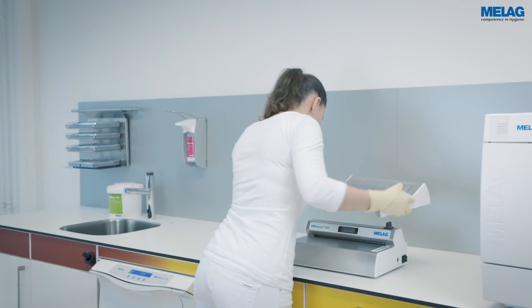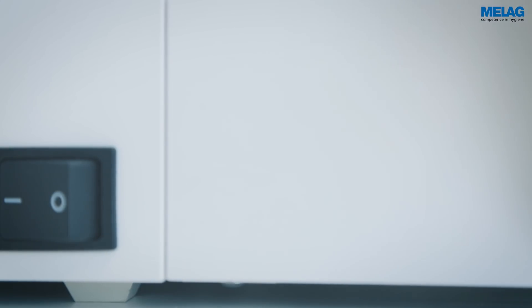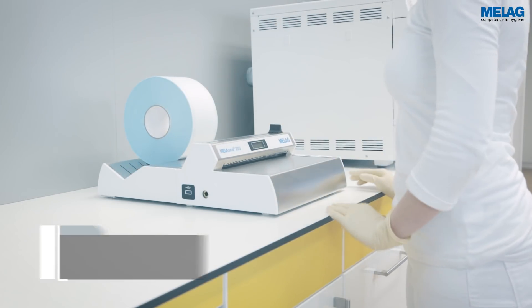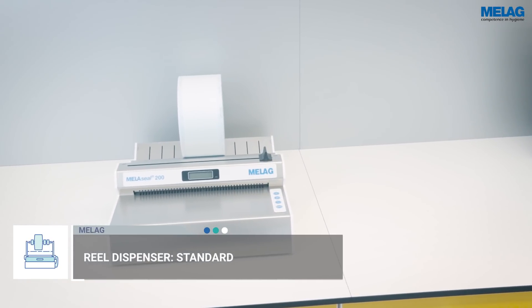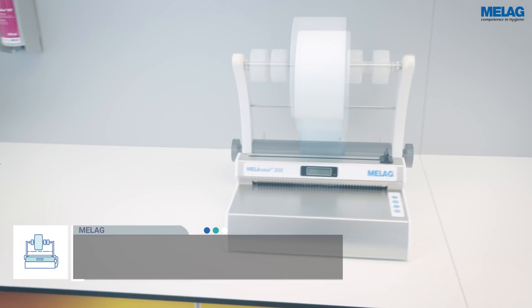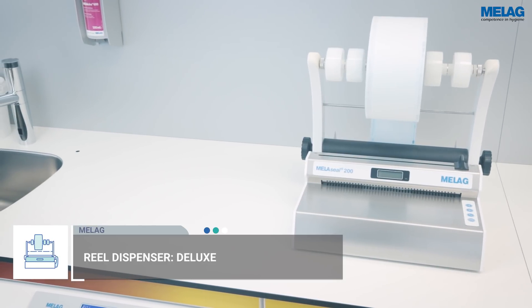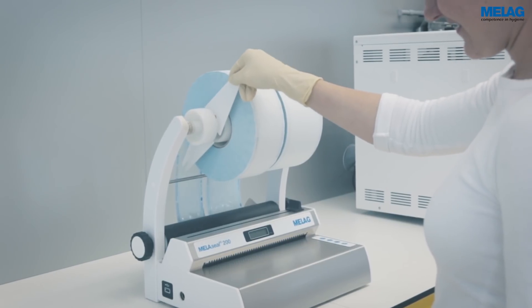If you have ordered a reel dispenser, please fix it to the rear panel of the MELAseal 200. The standard reel dispenser locates the rolls on the rear of the device. The comfort and deluxe reel dispensers hang the rolls above the sealing device, thereby saving space. The distance plates enable you to separate the rolls from each other.